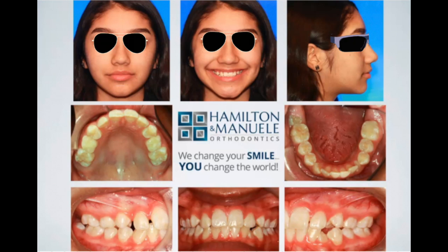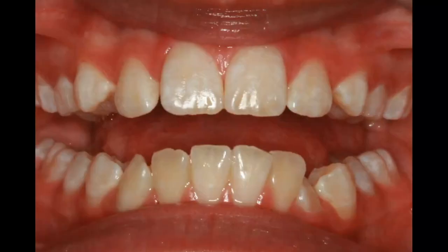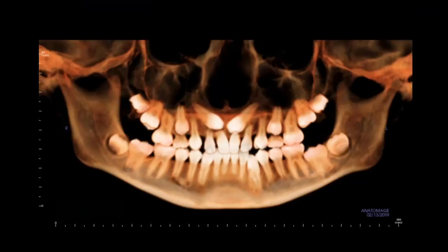All right, let's look at the teeth here. Okay, so not a ton of wear. I mean, that's nice. Maybe a little bit on the insides of the ledges there, but not too much going on from that standpoint. We found our canines.